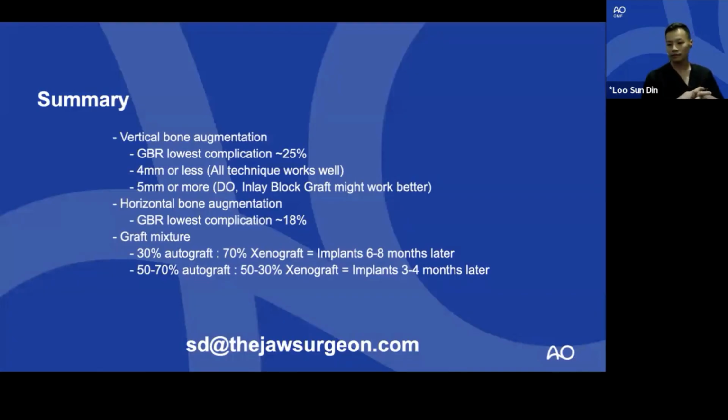Yeah. Okay. So I guess putting a collagen plug or something to absorb and get a stable clot is quite useful and effective in preventing a hematoma.